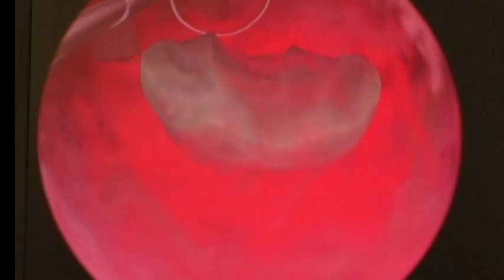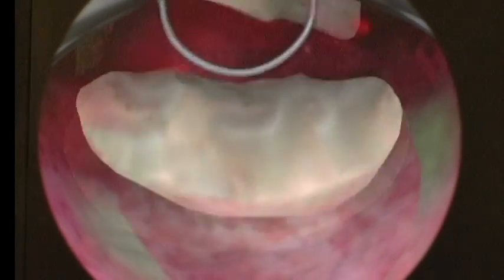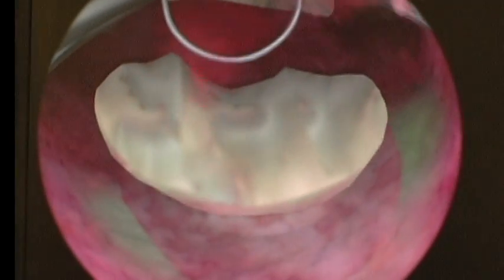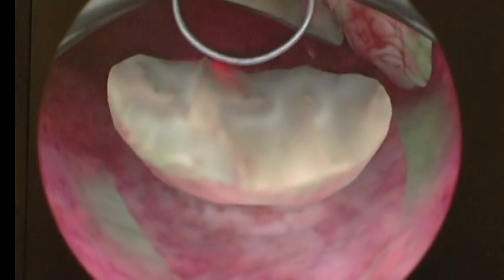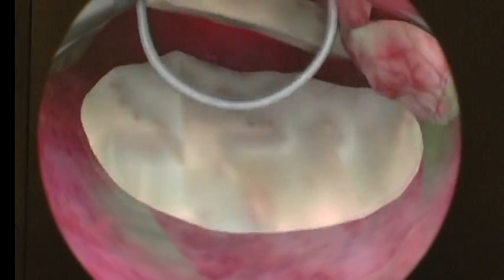It's very realistic. Right here it looks like I hit a big vessel from the fibroid, so I could use my fluid management or my outflow valve to flush the cavity better, find the bleeding area, cauterize it, so I can move on with the procedure with proper visualization and complete safety.